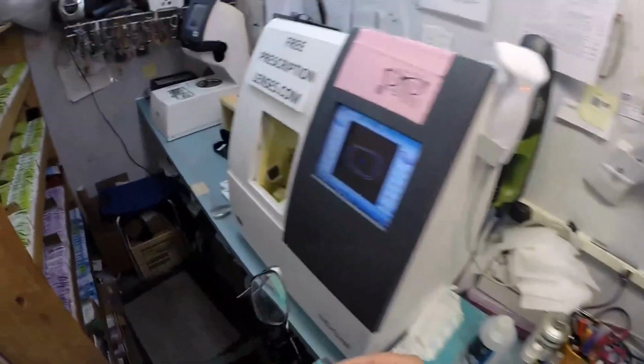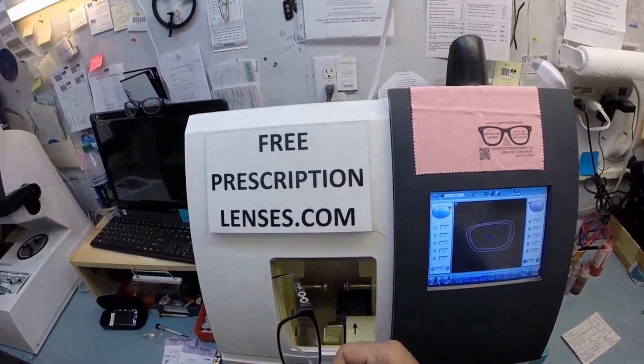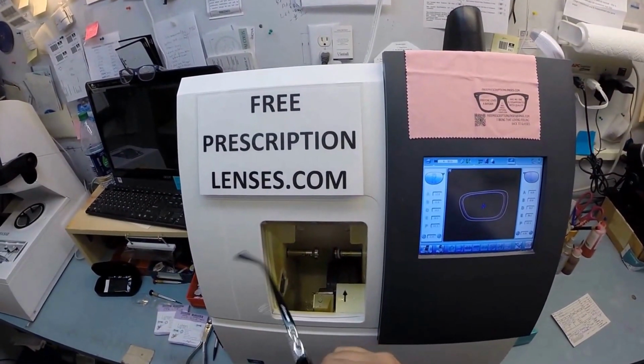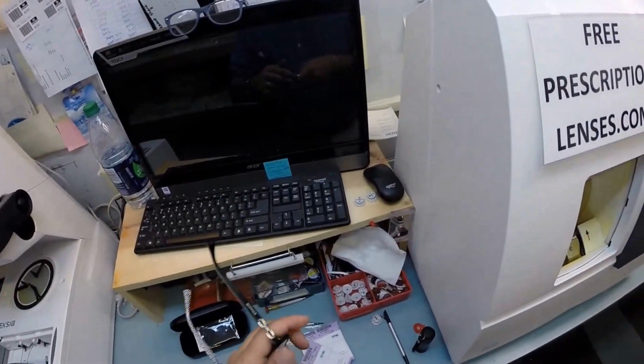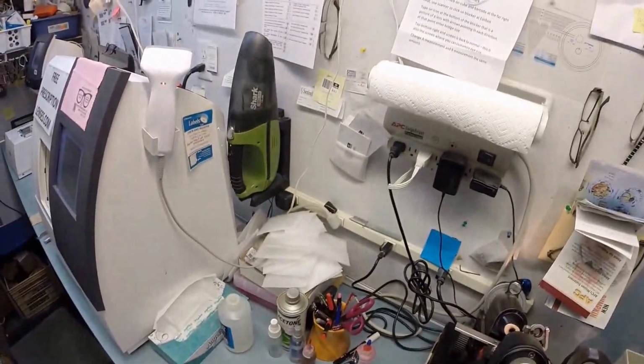Where's your glasses? I've already lost them. Okay, here they are. Let's go ahead and make sure your left lens fits. I'm going to tuck it in at the outside corner, and using my thumbs, I press down at the nose. It snaps in perfectly. Let's go ahead and take this block off. It is no longer needed. Come back down here, and we're going to put it in just above that red dot.